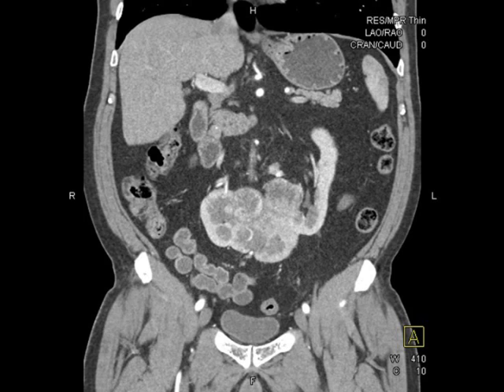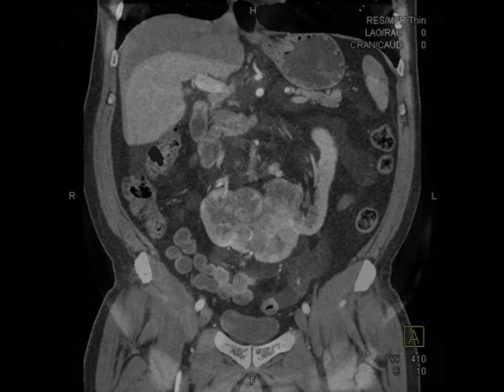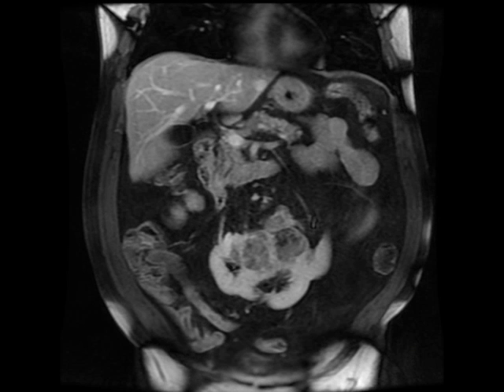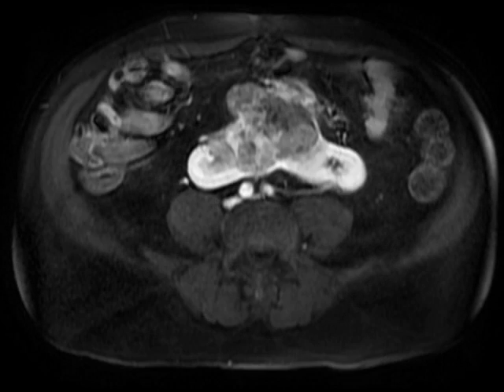This is a classic example of a horseshoe kidney, but I'm not going to show you just a horseshoe kidney. Notice that there's a large hyper-enhancing, hypervascular mass arising from the central aspect of this horseshoe kidney, involving both the right and left renal moieties. You see the same features on MR — it's hypervascular, it's heterogeneous, and it's got a central scar.